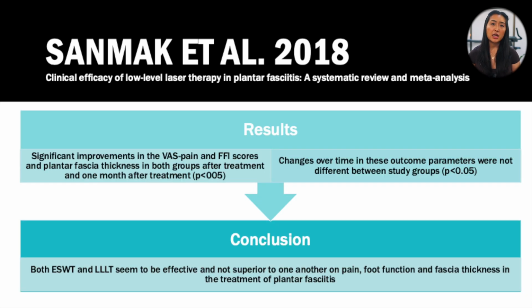So in conclusion, they reported that both shockwave and laser therapy seem to be effective and not superior to one another on pain, foot function, and fascial thickness in the treatment of plantar fasciitis. This conclusion is great for us in the physical therapy setting because the evidence is in favor of using these non-invasive treatment options in making a positive outcome on our patients' rehabilitation process.